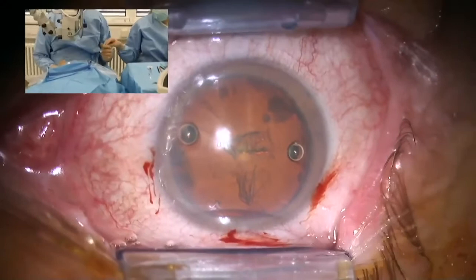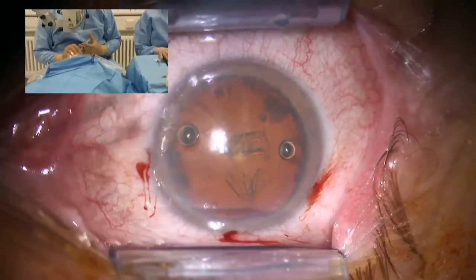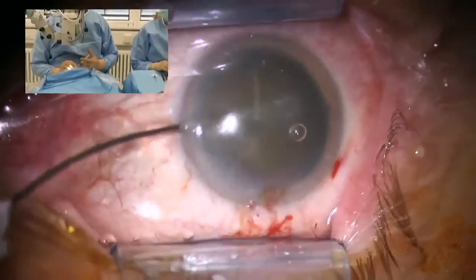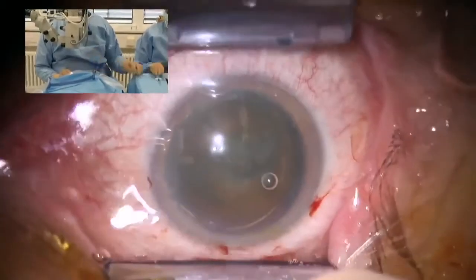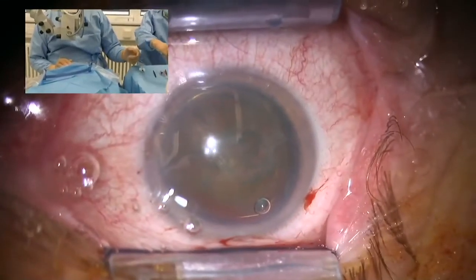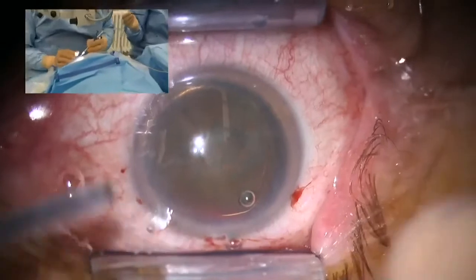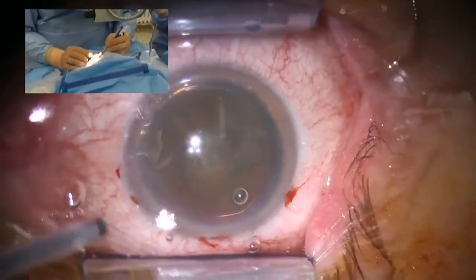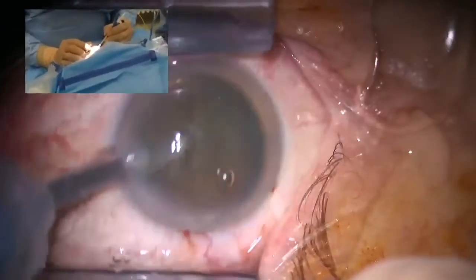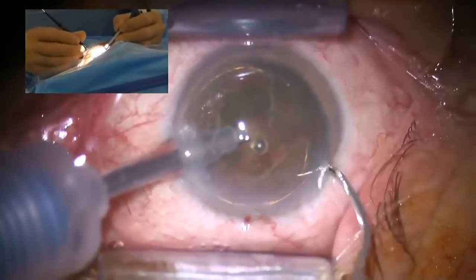The firing rate is up to, let's say, 8 hertz in this setting, because the triggering of the laser pulses is via the vitrectomy port. So what you basically do is you behave like you are doing a vitrectomy with your phaco machine. And those air pulses are transduced into electrical pulses inside the laser. And if you have, let's say, 500 rounds per minute vitrectomy frequency, you will end up in a frequency of 8 hertz of the nanolaser. So you hear the 8 hertz, and you can trigger. Sometimes it's slower, sometimes it's more speedy, and you do this by your foot pedal.